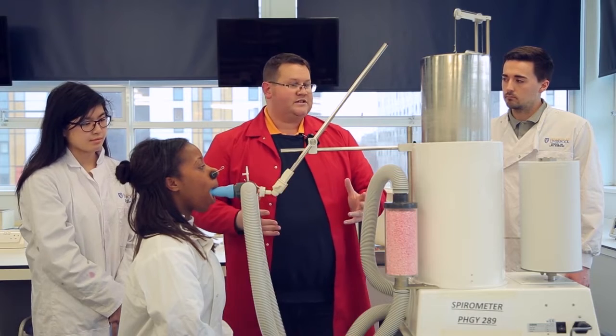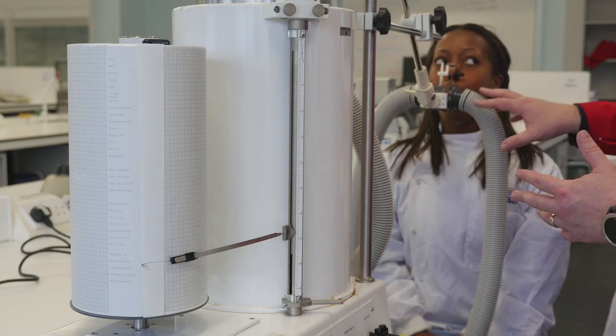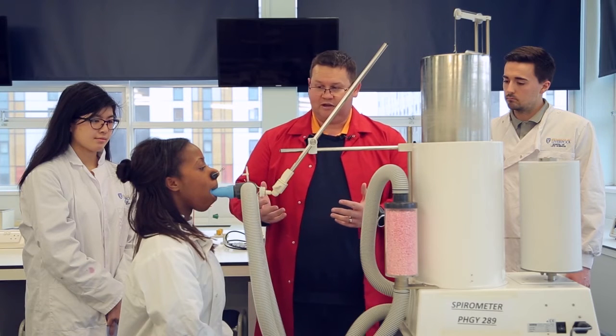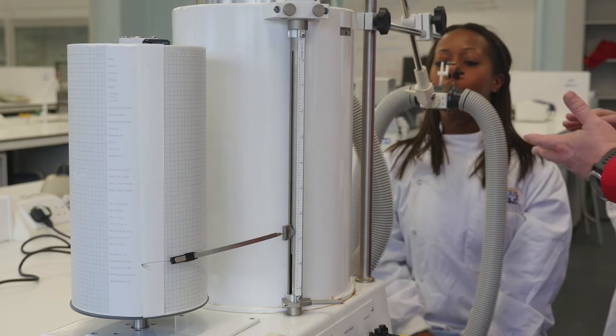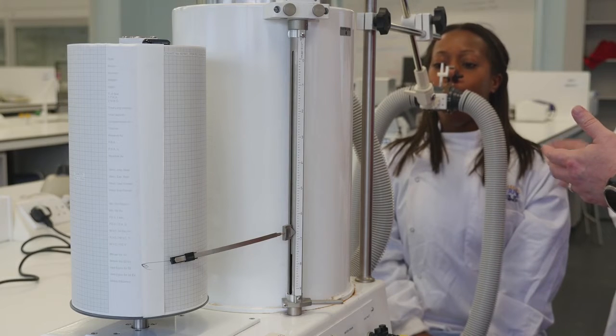The reason I'm operating it this way is so that you've got an opportunity to just get used to the breathing pipes — probably a good two inches in diameter — but essentially you would be allowed to breathe through that and there shouldn't be any issue. If you're feeling uncomfortable and nauseous at any point, please just back away from the machine but stay seated. You don't need to ask for permission.